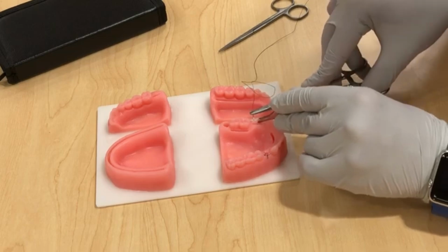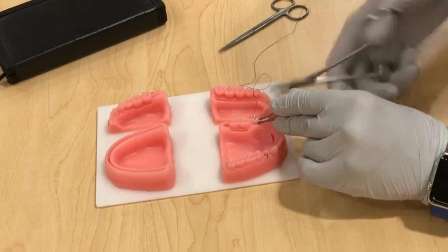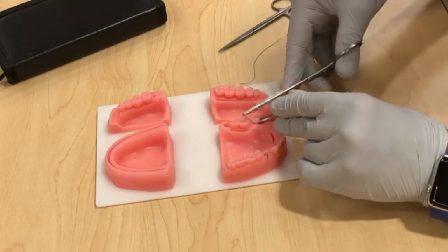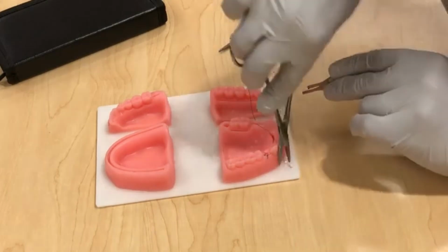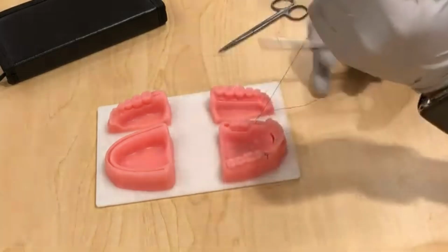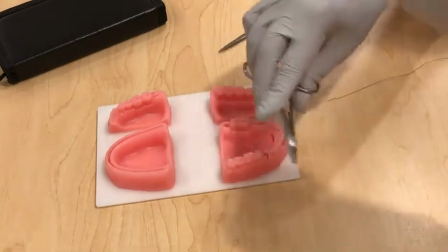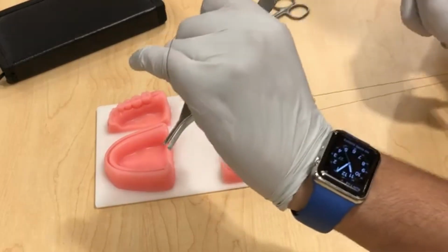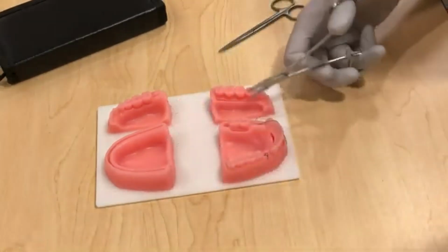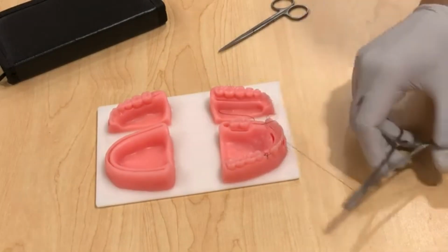So I'm going to grab my tissue like that, and then I want to rotate like my arm like this. Do not push it, just rotate it. It's going to do its job. Then I'm gonna take it all the way. So, and I have a tip for you, a trick. Instead of pulling all the way like this, you may hit someone. You could just place an instrument like that and then just pull it like that. Okay, but be careful, don't lose your short tail, and we'll always leave it at about an inch.